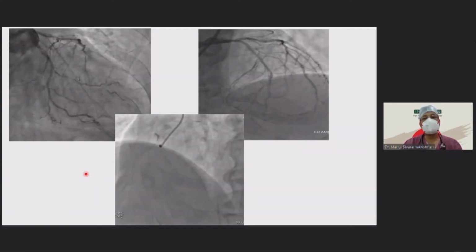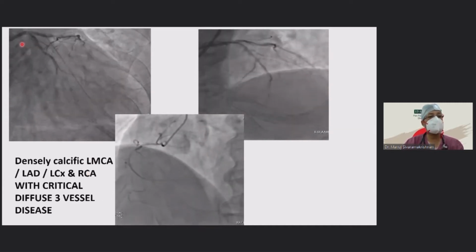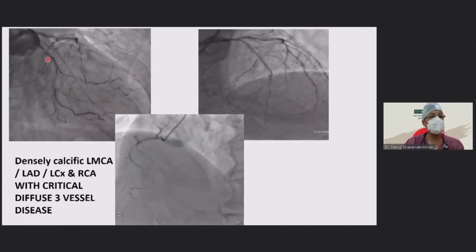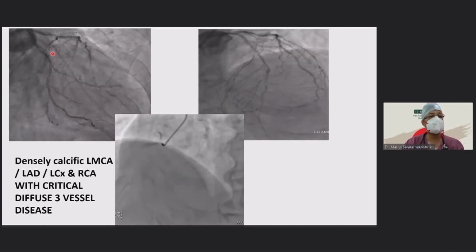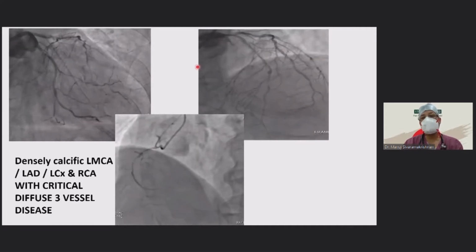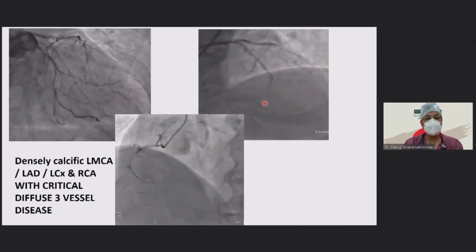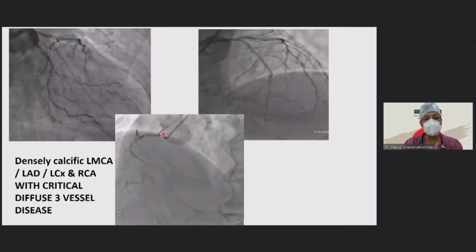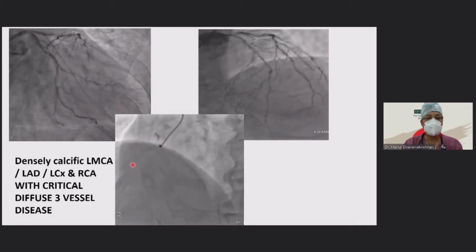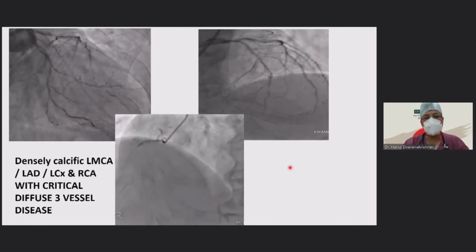So you would appreciate that this is the angiogram of this gentleman, which shows a heavily calcified, very short left main, heavily calcified mid-circumflex and proximal circumflex, diffusely diseased OM vessels, and heavily calcified proximal to mid-LAD and distal LAD vessel. And the RCA is very poorly perfused because of the intense level of heavy calcium. Because of these reasons, the surgery was denied for him.